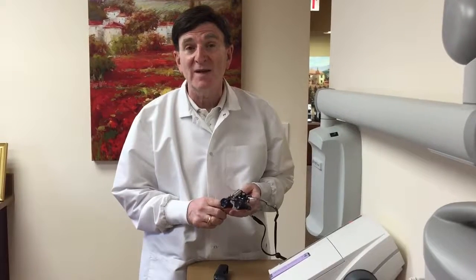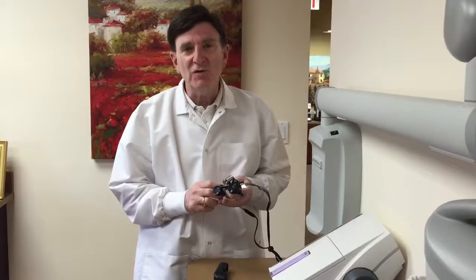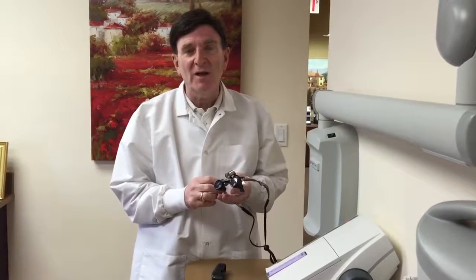Hi, my name is Dr. Cary Gans and I'm the CTO, the Chief Technology Officer at Odin Technologies. What I wanted to show you today is how to use our Odelux Plus wireless headlight.